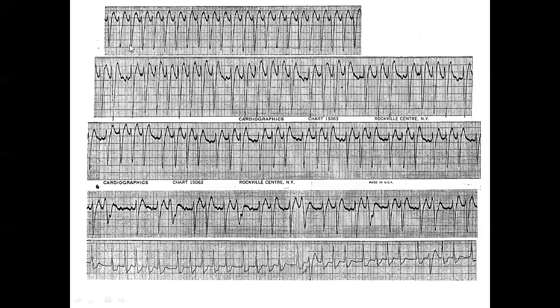Okay, here's a patient with a perfectly regular rhythm, very fast. Then a moment later, there's group beating. Now 6 together, 4 together, 3 together, 4 together. Okay, is the first one a little bit longer than the next one? Yes, the first one is a little bit longer than the next one. Can you put two of these in here? No. There are good earmarks of AV Wenckebach phenomenon.